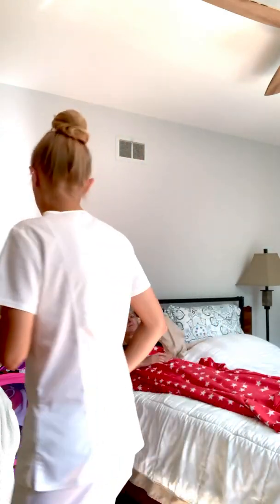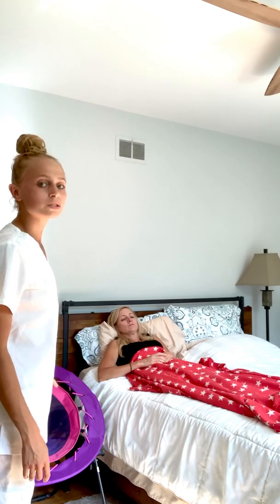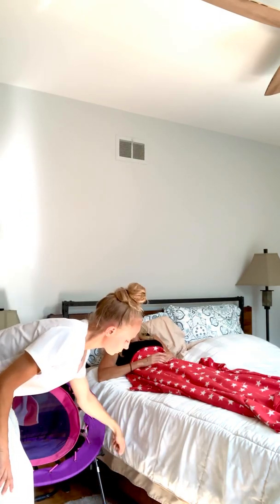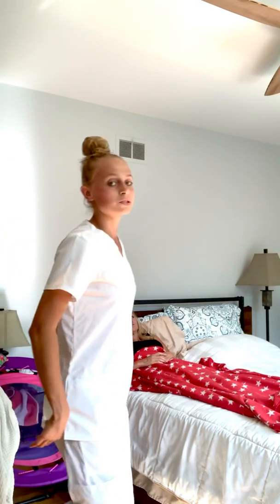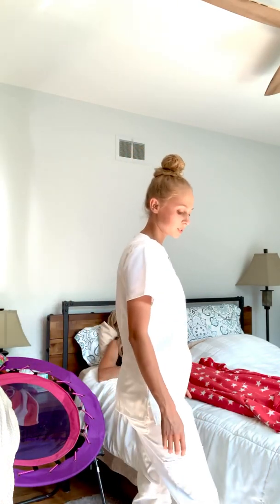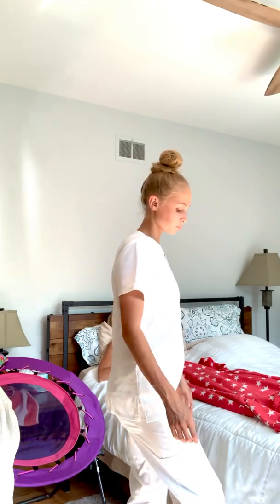And now I'm just going to make sure that the wheelchair wheels are locked and that the foot plates are up as well. And then I'm also going to be lowering my patient's bed to the lowest position, and I'm also locking the bed wheels as well.